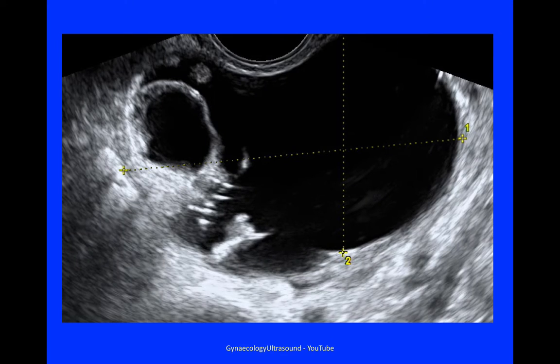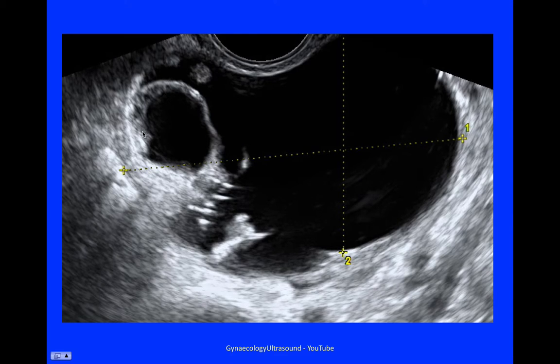This was an 80mm multilocular cyst — there is more than one locule — with mixed echogenicity. The walls look to be irregular, there is no shadowing behind, and there was some moderate vascularity. So this was a slightly less typical dermoid.